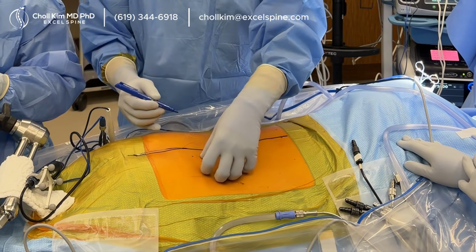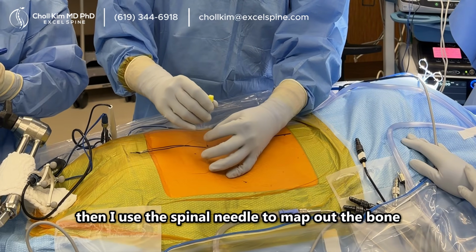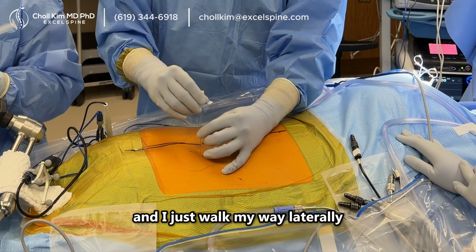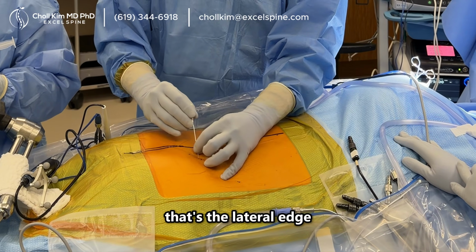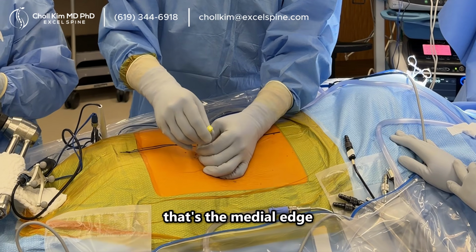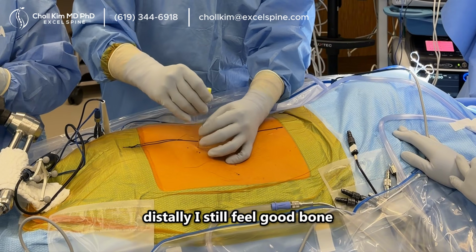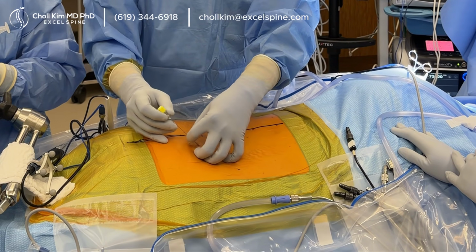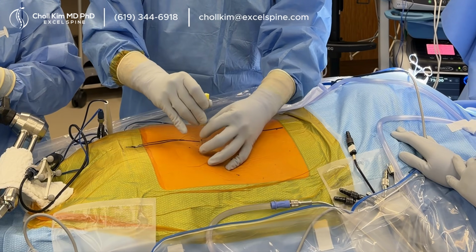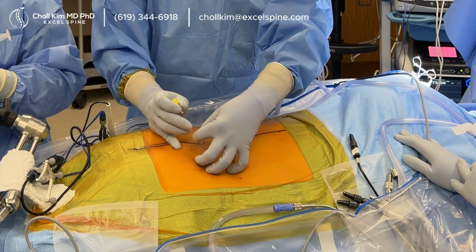So I put a dot as to where I think the center is. Then I use the spinal needle to map out the bone. And I start in the middle and I just walk my way laterally. That's the lateral edge. That's the medial edge. Distally, I still feel good bone. Proximally, I still feel good bone. It may be even better right there. Yes, it is. No, it's not, because proximally there's very little bone.